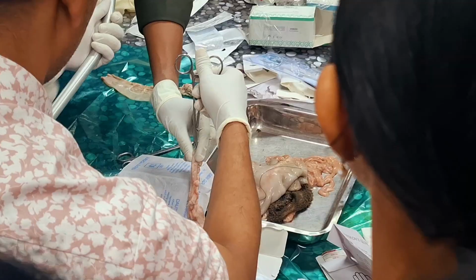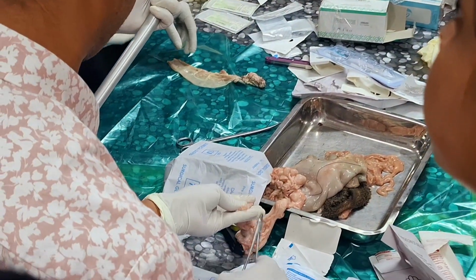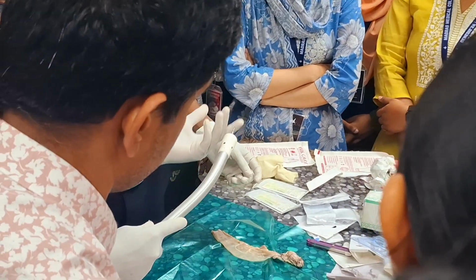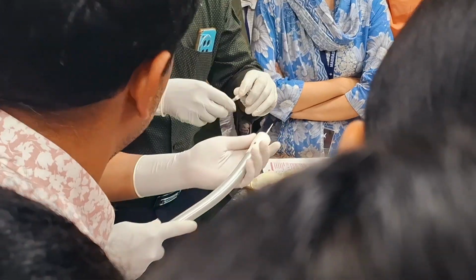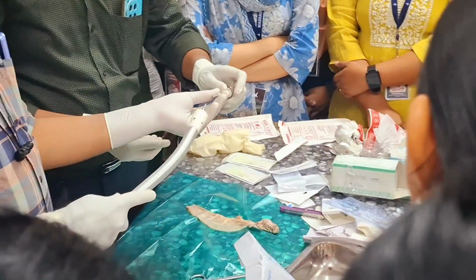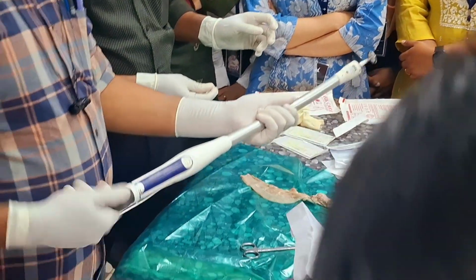And this stapler will have two parts. It usually comes like this.